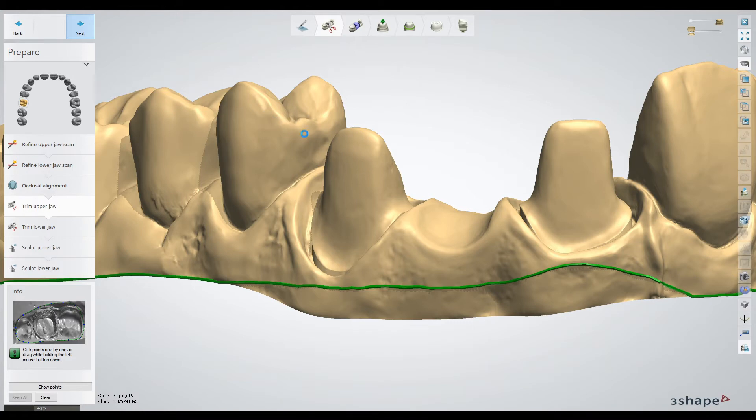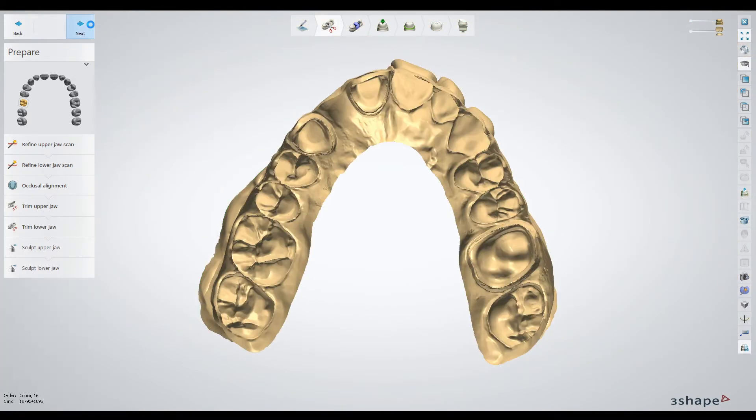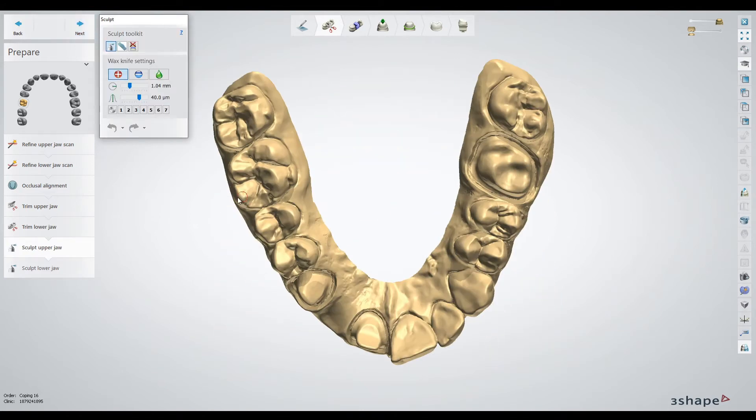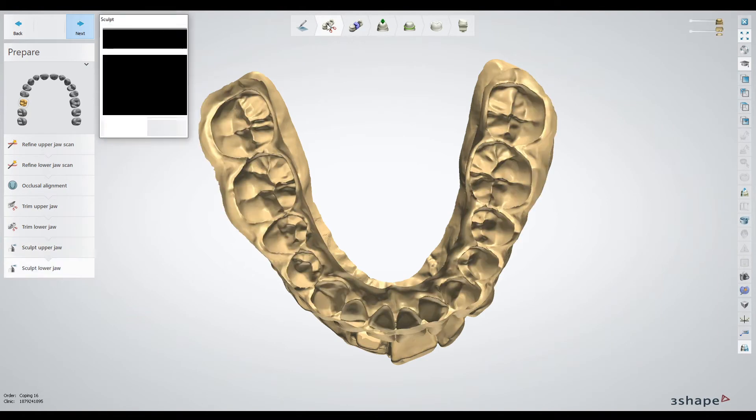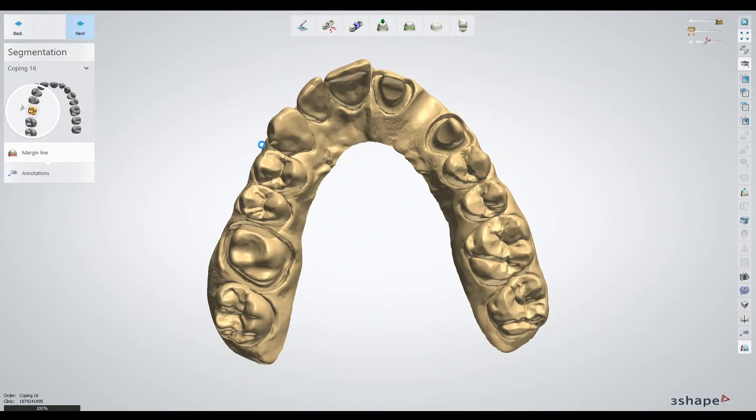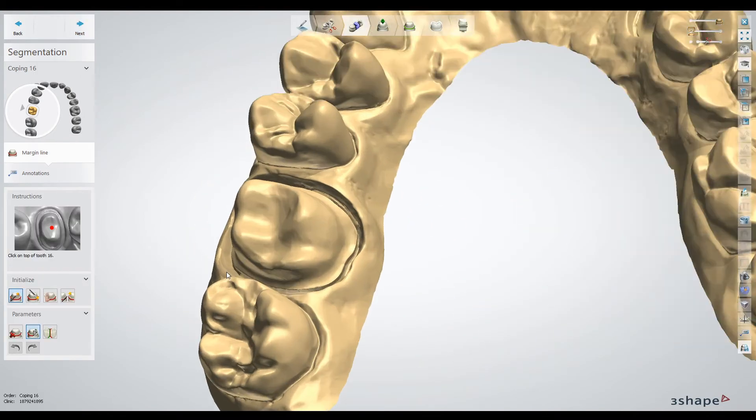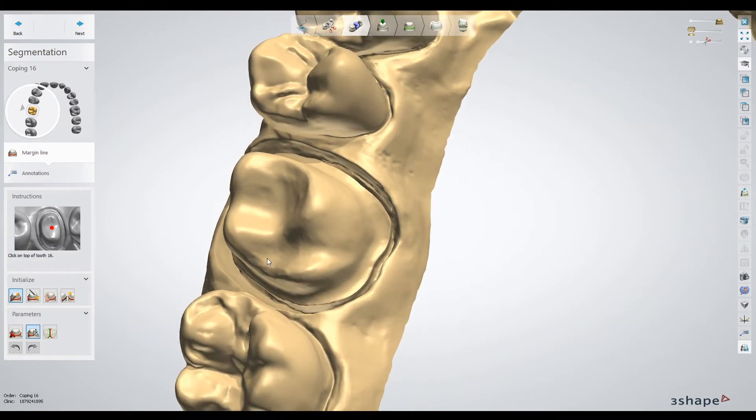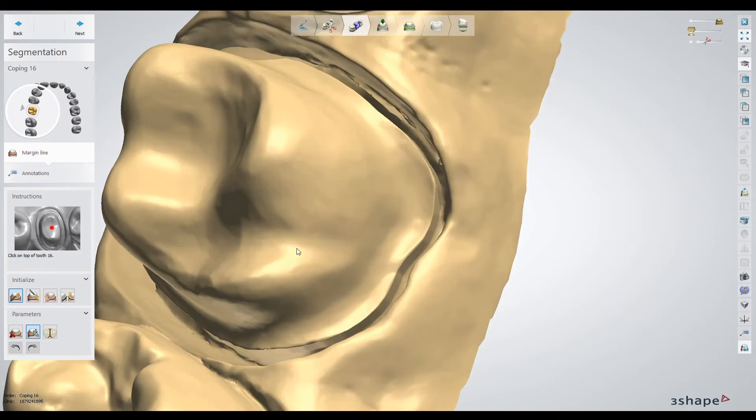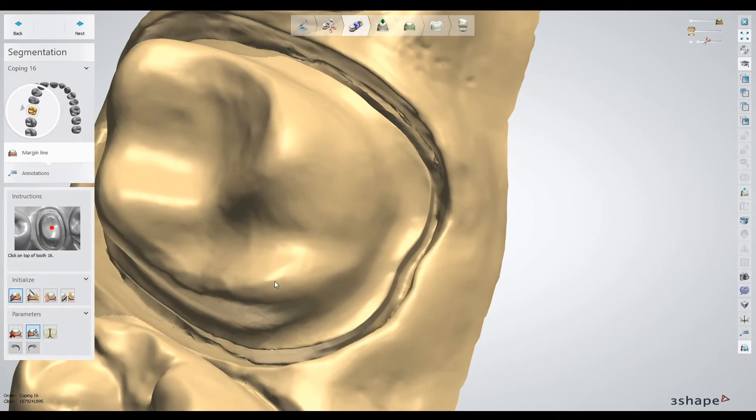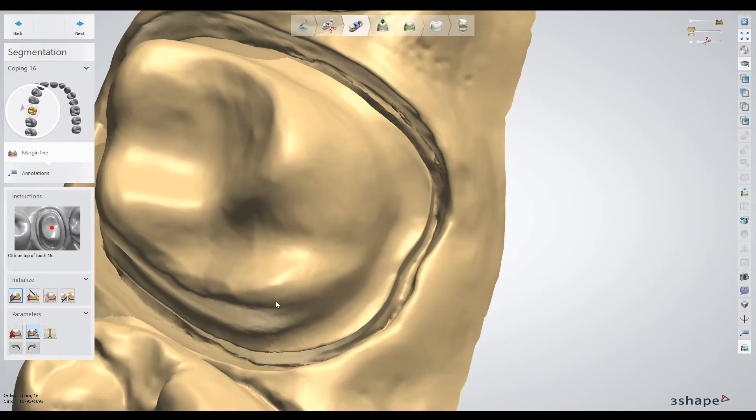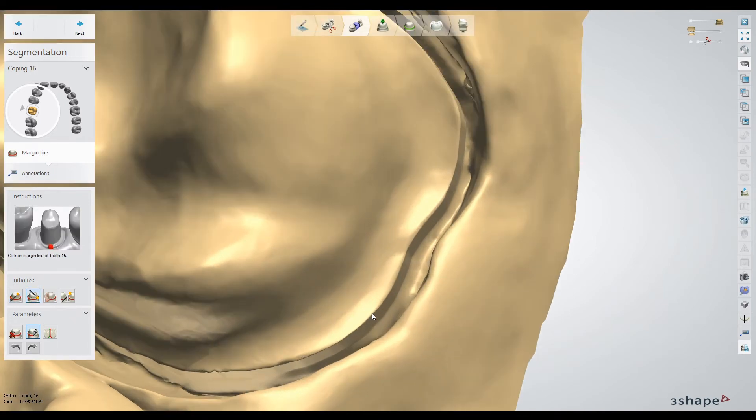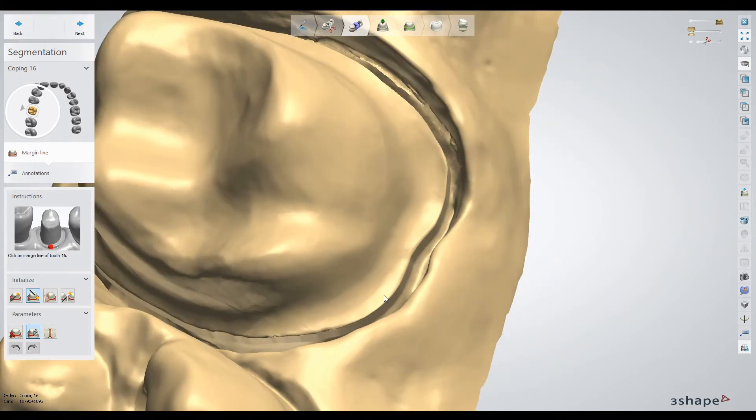One last step that's important for the model part of the process: there are two points where you can select the margin. The first one is called segmentation. Once I hit next a couple times, this is sort of the first step to margin marking. I recommend that you just mark the margin like normal in segmentation, and then when it goes into the actual margin marking step, it will just copy that. The reason they break this up is because this step is where it's cutting the tooth from the mesh, so if you wanted to have the perimeter of the cut much wider than the actual margin and where the die is actually being cut from, you can.